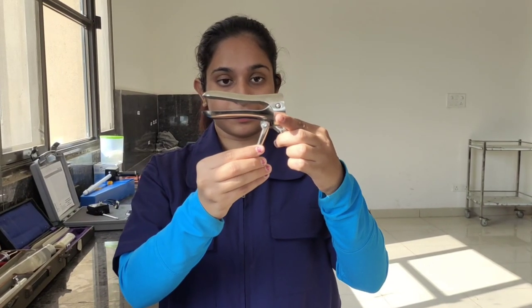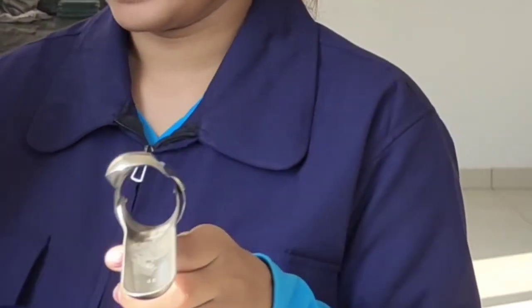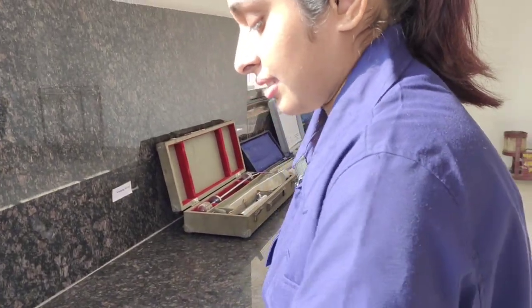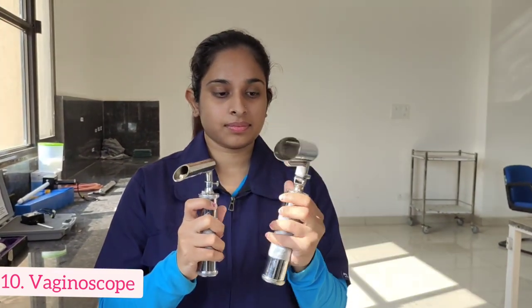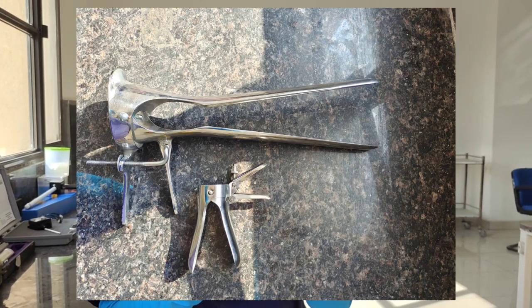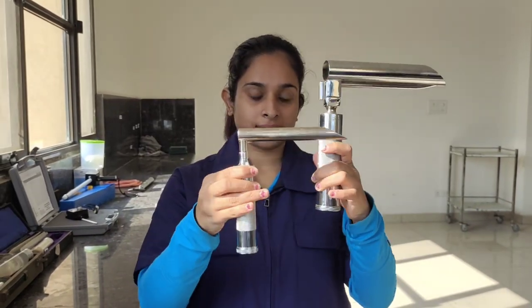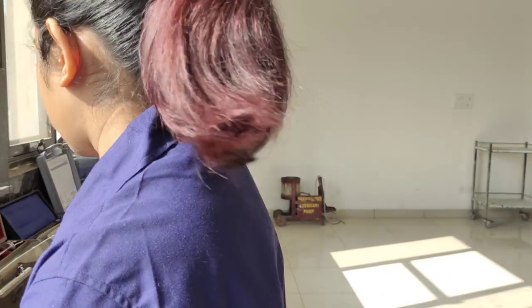The next instrument we have here is called the vaginal speculum. This instrument is used to dilate the vulvar lips for examination of the internal contents. The next instrument is called the vaginoscope, which has a light scope provided in it. We can use the light from the vaginoscope along with the vaginal speculum for easier examination of the vulvar lips and the internal layers of the reproductive tract.